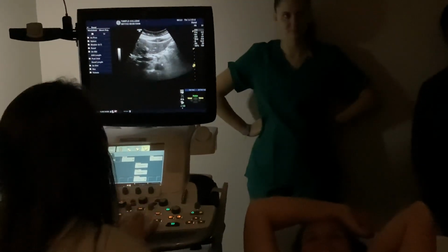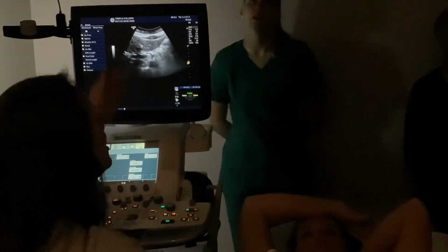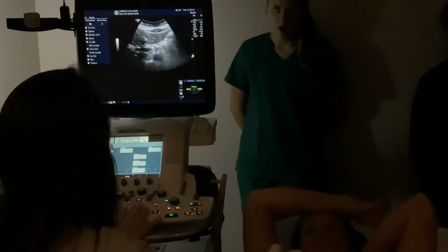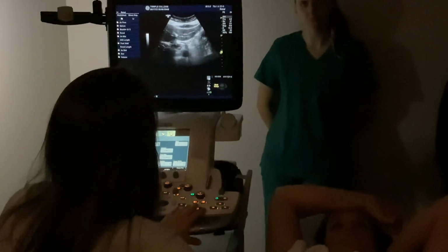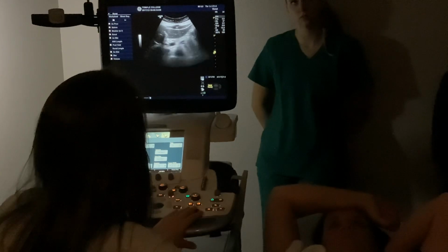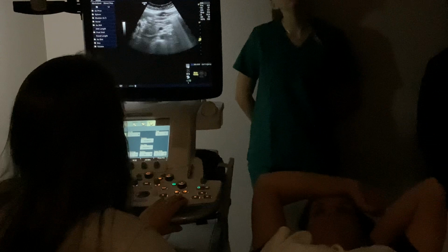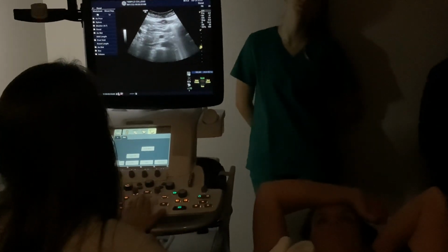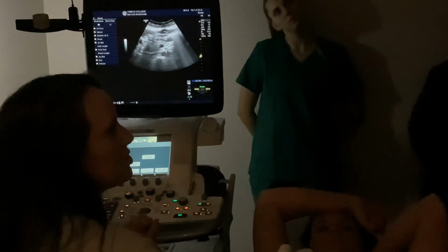Excellent. So we'll look at those and I'll start scanning. So this is your landmark for mid. If you see this, you've come too far, so you need to go back up. Your proximal should have a lot of liver in it. Deep breath. Ooh, your trunk is pretty. See it? It looks like a seagull. And the SMA is going to be right here. Good. Breathe. It's getting a little gassy, so it's getting harder to see. So that's your other little landmark. It tells you you're in mid.